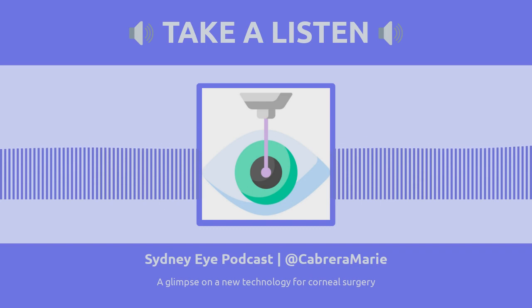Yes, now with all new technology and new medications, there's always going to be potential risk. So let me just take the listeners through a few unexpected events that happened during the course of our study. We found that we laser the patch with a handheld laser slowly, but if we accidentally left the laser on one spot for too long, it actually burns the patch. Now, whether or not it causes any cornea damage, we're not sure.